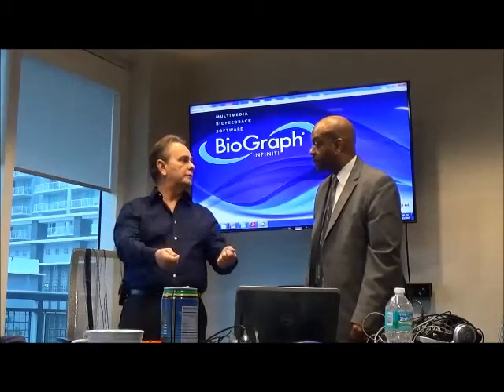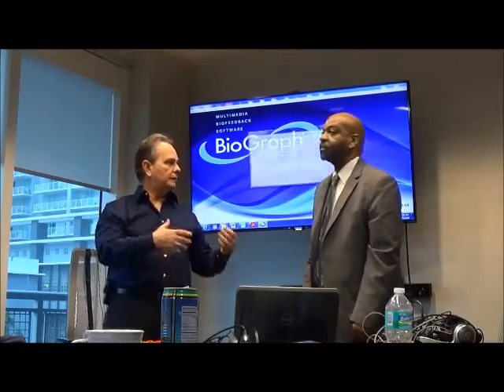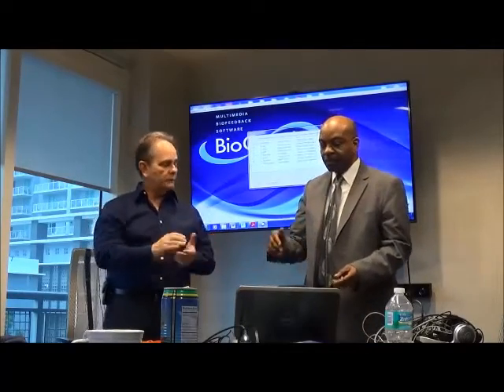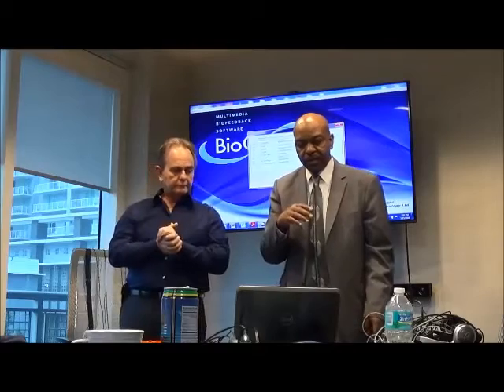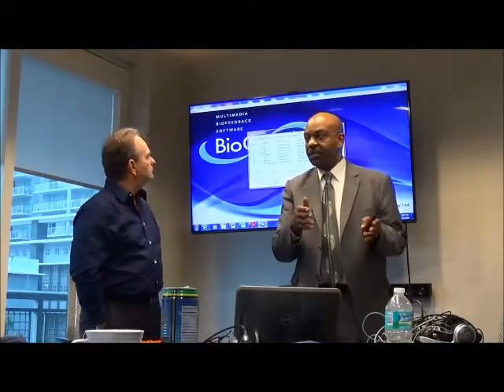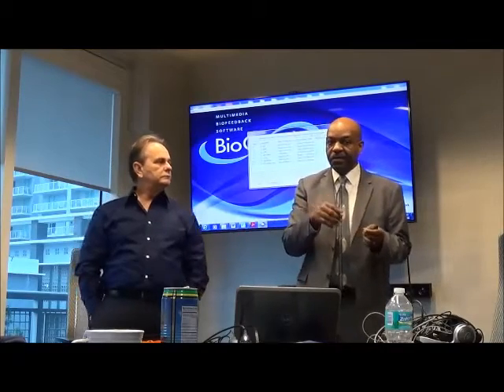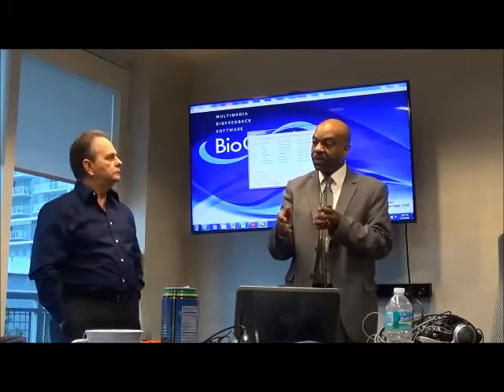I introduced the stressor either by the Stroop test or so you're doing it manually. Manually, yeah. There's in this software, and in many of the biofeedback software, there's usually a way to just record without any set amount of time, and then there's also a way to record with a set amount of time.